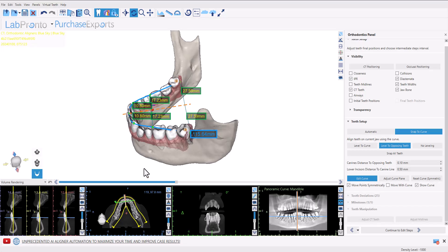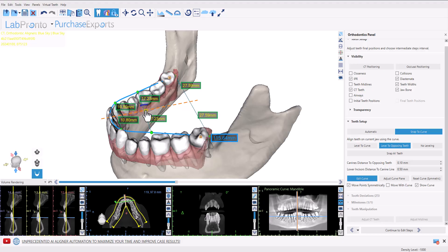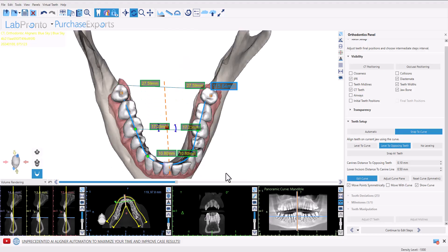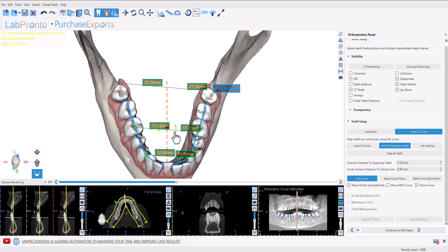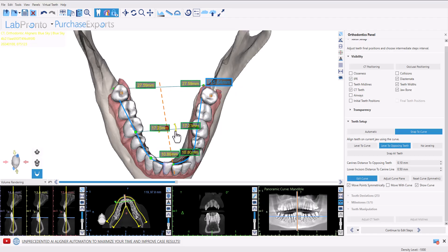If needed for improved visibility, the height positioning of the curve can be raised by grabbing with your left mouse button the red square in the middle and dragging it accordingly. The rotational positioning of the curve can be adjusted as well by using the blue arrows in the middle of the curve, grabbing and dragging with your left mouse button.